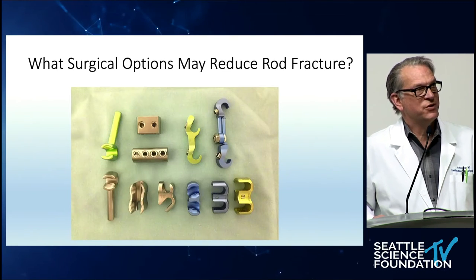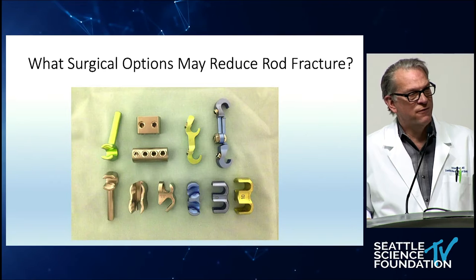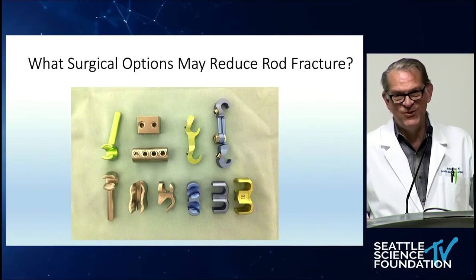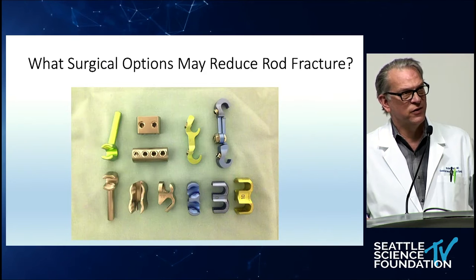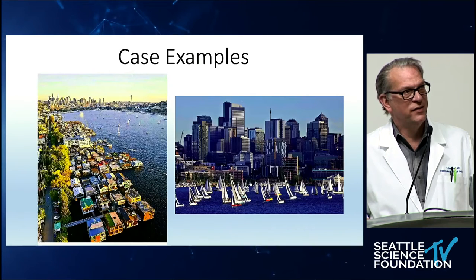So what surgical options may reduce rod fracture? Here's a photo of several of the connectors. This, again, needs an update. There are several more, and I've always felt that most implant designs focus on the screws and the rods and the reduction tools, and then the design team goes out to have a celebration over dinner, and somebody says, oh, we need domino connectors, and somebody picks up a napkin and scrawls out a few designs. They seem to have gotten short shrift a lot of times, but that's changing, and I think these are now going to be more variable, more robust, and more easily applied than they have been in the past.